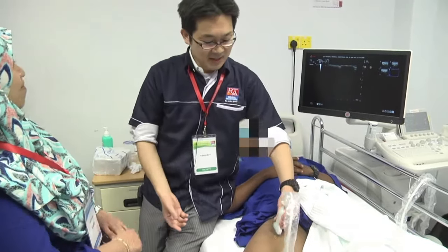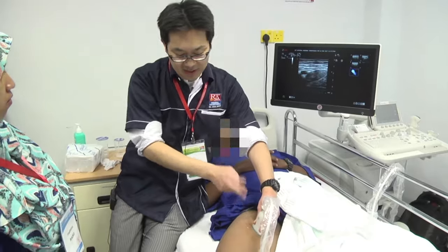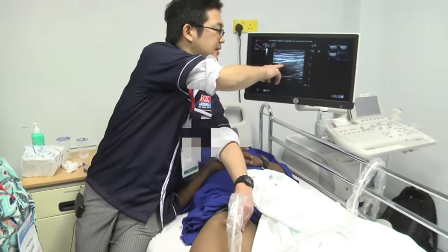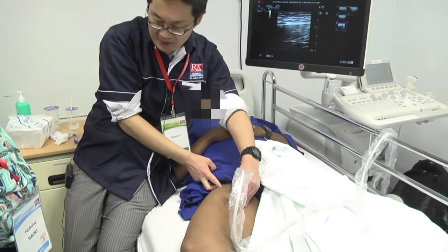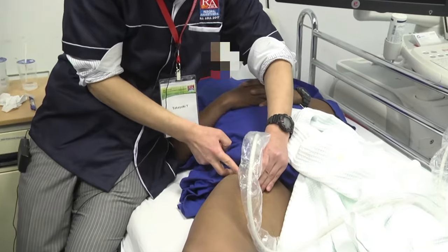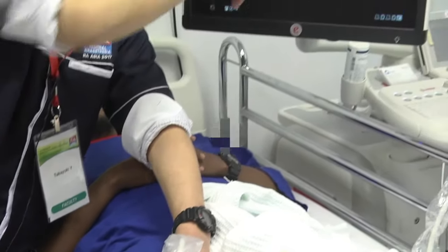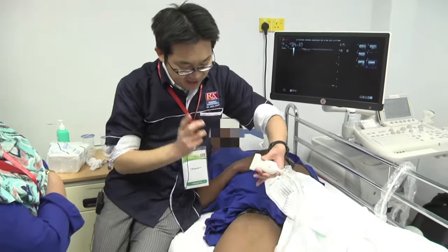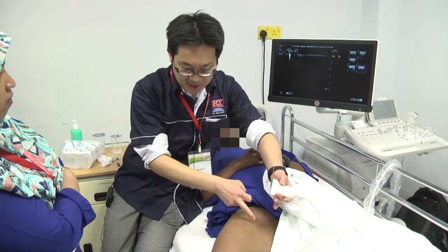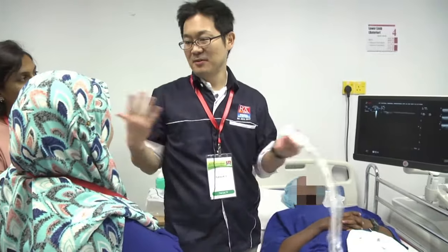But in my practice, I insert the catheter from here by using a 15 centimeter needle. Very long needle. So first, I identify the adductor canal like this, then rotate clockwise like this. Then here is the target, and I insert the needle from here using a long needle and trace the needle advancement, and finally the needle tip reaches the adductor canal. Then I thread the catheter through the needle. So the insertion point of the catheter is here, but the tip of the catheter is located here. So it works, but very complicated. So I don't recommend this technique for others. Yeah. So there are three solutions, I think.